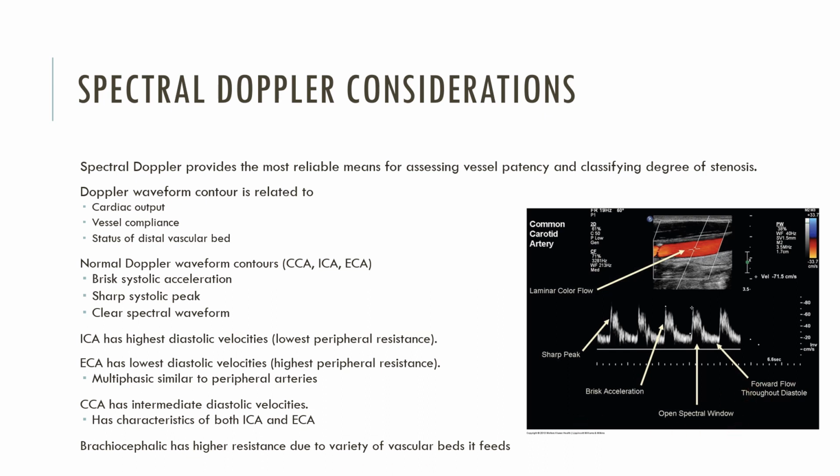It's demonstrating that this line here, at this moment in time, was obtaining information from cells going at a maximum of 70 centimeters per second, all the way down to a maximum of, let's say, 35 centimeters per second. So all the cells in that range at that particular moment that this line was drawn were traveling in that range from 30 to 70 centimeters per second.